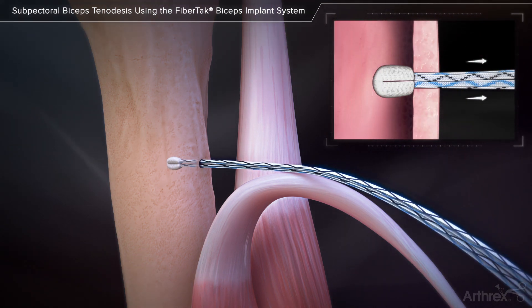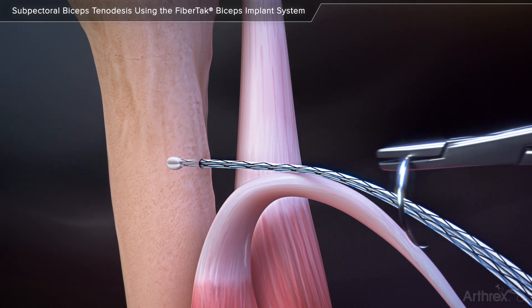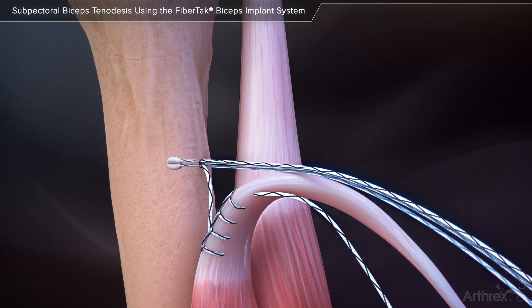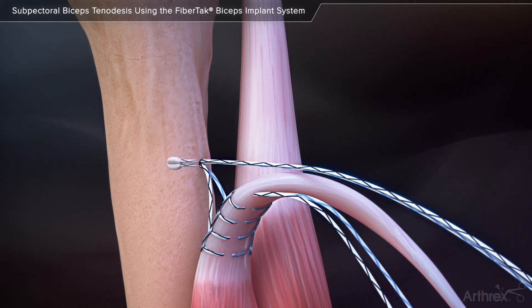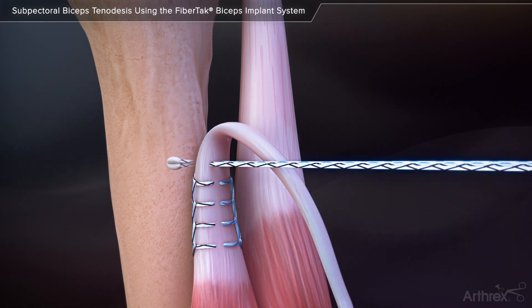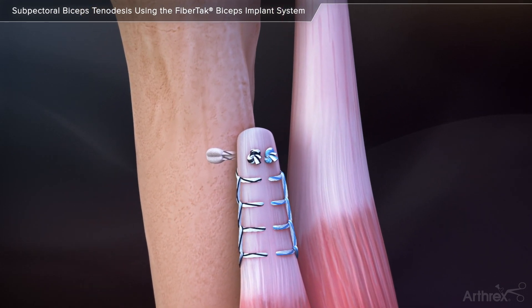Remove the four needles from the needle guard. This implant supports multiple stitching techniques to accommodate surgeon preference and tendon morphology. Pass one or both of the sutures through the tendon and cut the needles from the suture limbs. Pull on the opposing free suture limbs to reduce the tendon down to the bone. Securely tie the sutures and cut the remaining tails to complete the repair.